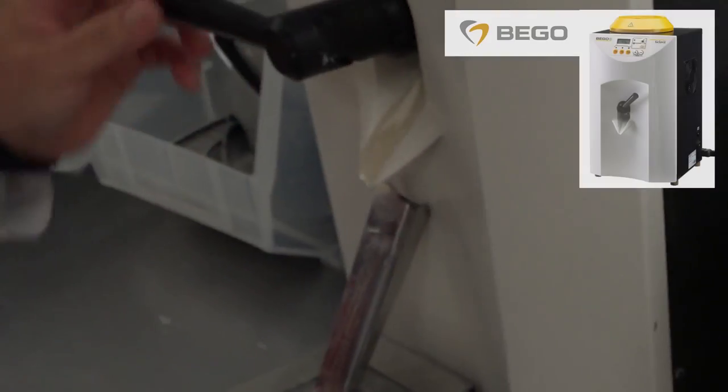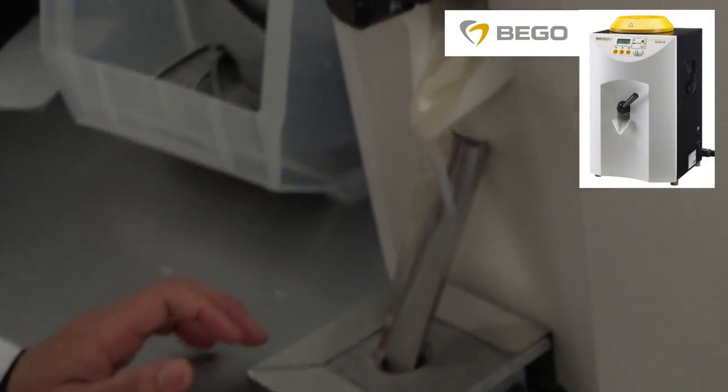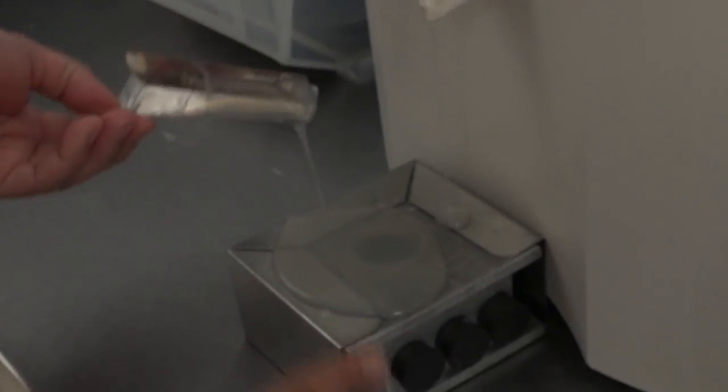Fill mold with duplicating material. Allow to sit for five minutes, then place in water for five minutes.